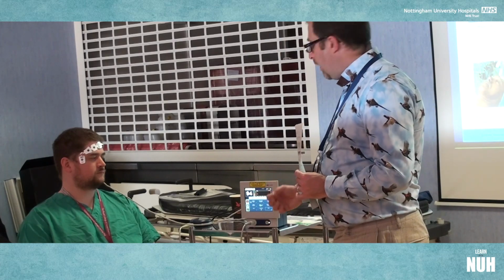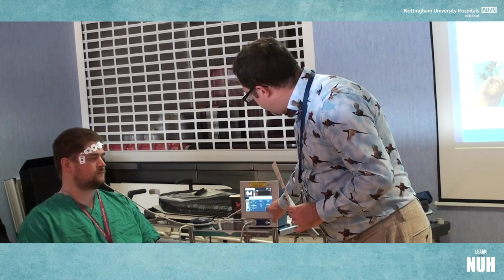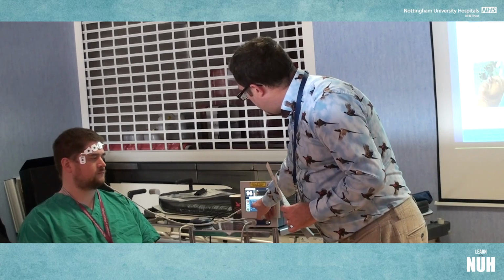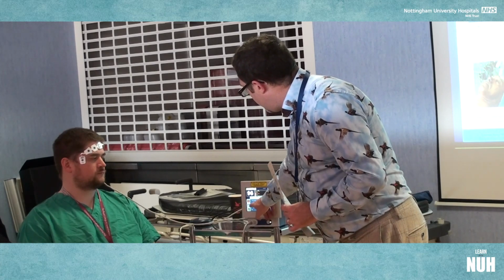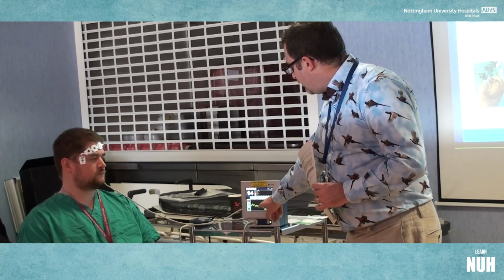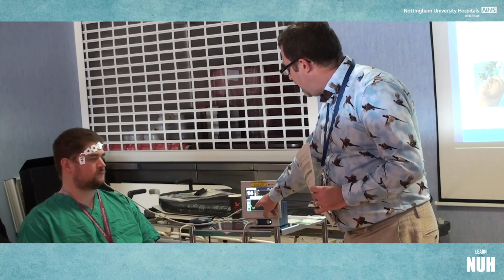What we need to do is turn the filters off. So the way we do that, if we go back into the menu and click next, and then next again, filters on or off. Okay, so we turn the filters off, so we've got the red square, and we'll see more readily now what we're going to see here. So that is actually a delta peak, but we'll see the waveform of the EEG in a bit more detail there.